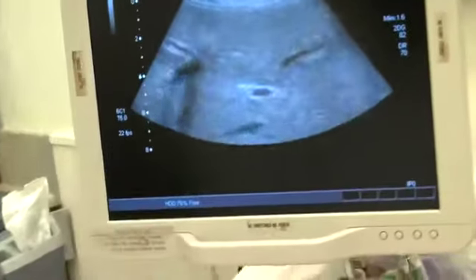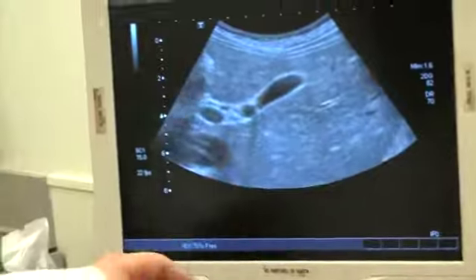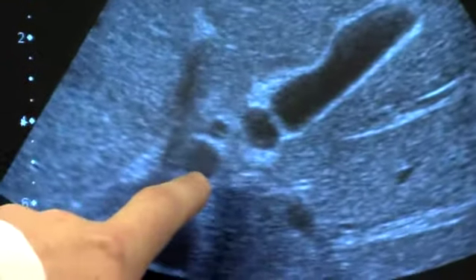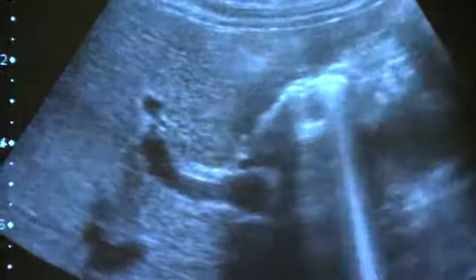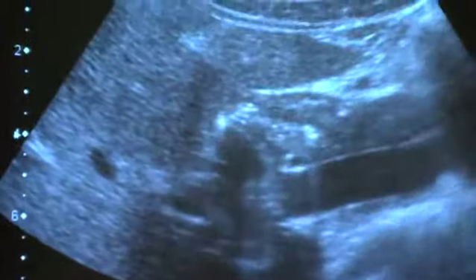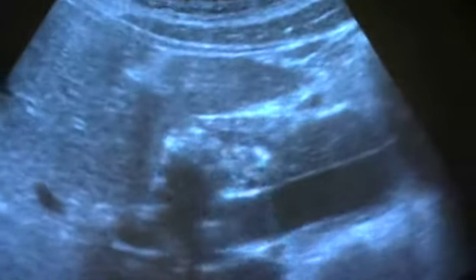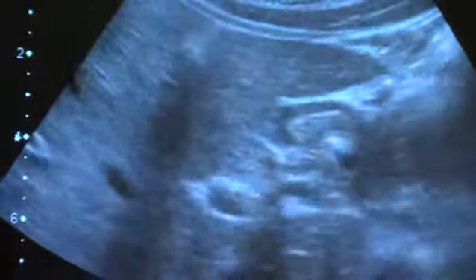Okay. This is the view you want to get the common bile duct. You want the long axis view of the gallbladder. You're going to find the portal vein, which is the dot of the exclamation point. The portal vein is transverse axis. So in order to get the portal vein in the long axis view, which is what you want, you're going to turn 90 degrees until it stretches out in its long axis view. I believe that's the portal vein right there. And the common bile duct is just anterior to the portal vein, running completely parallel.